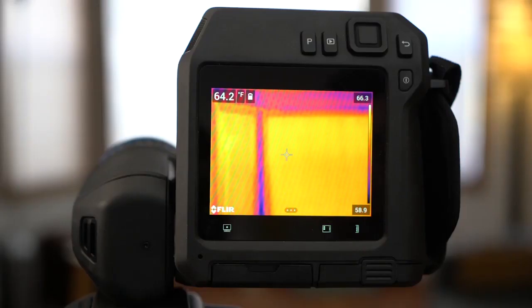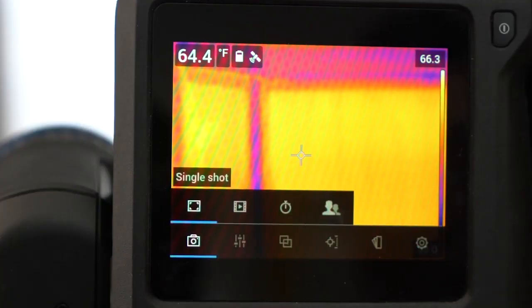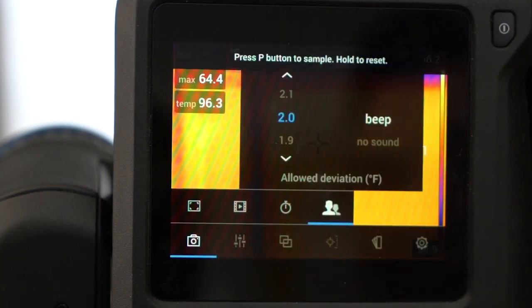Now, we need to set the imaging mode to screening. Tap on the screen to bring up the menu and click on the camera icon on the far left. Select the screening mode icon on the far right.